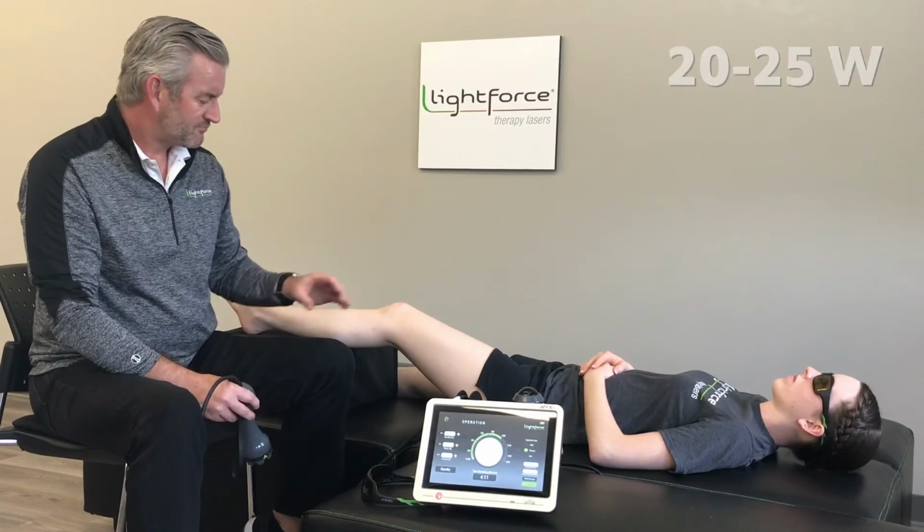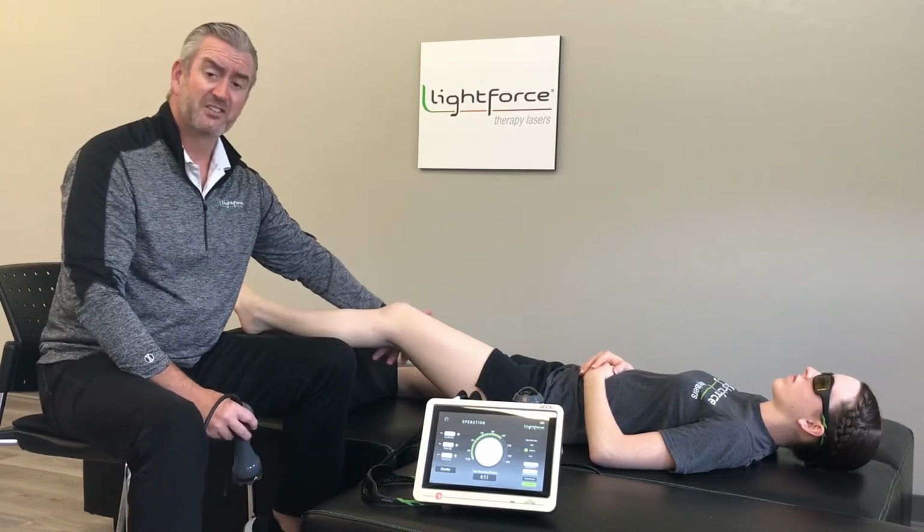So it's not uncommon to go up towards 20, sometimes even 25 watts to get maximal analgesic effects. I would recommend starting on that slightly lower side, around 20 watts of power, and then building after the first couple treatments once you see how the patient responds to that. Again, you're going to try to treat circumferentially around the knee and get your best outcome.